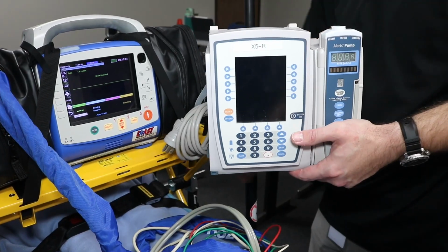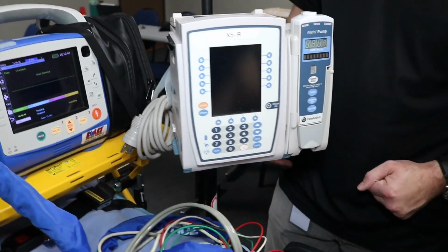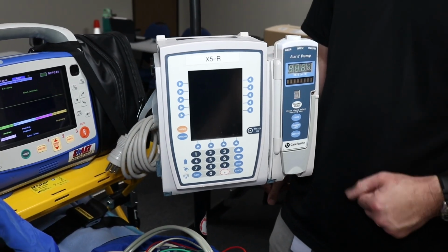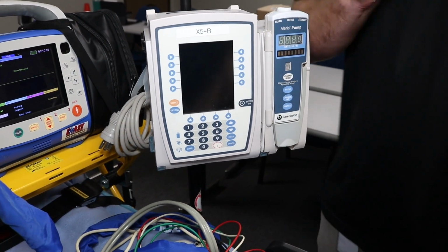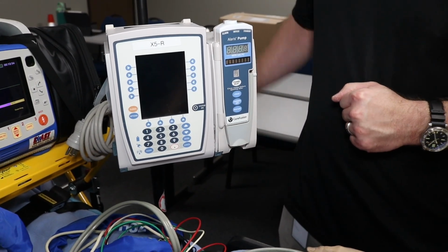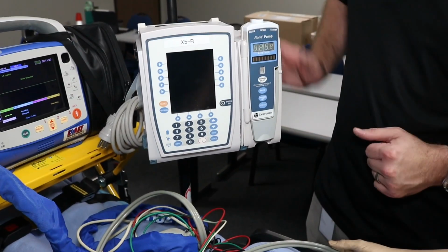Again, I'm going to check this and I'm going to check this bottom one too. Again, make sure that this is not going to slide down, land on the patient's lap, or fall off of the IV pole and possibly damage our pump. Make sure that we have the screen facing the bench seat where the nurse can see it and get at it. And make sure that any obstructions are cleared for our IV tubing.